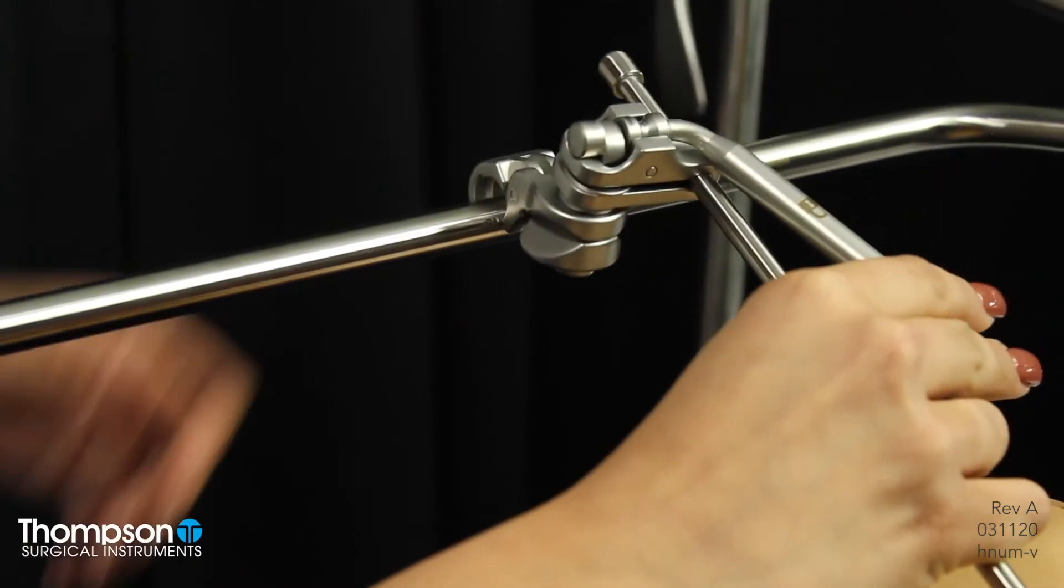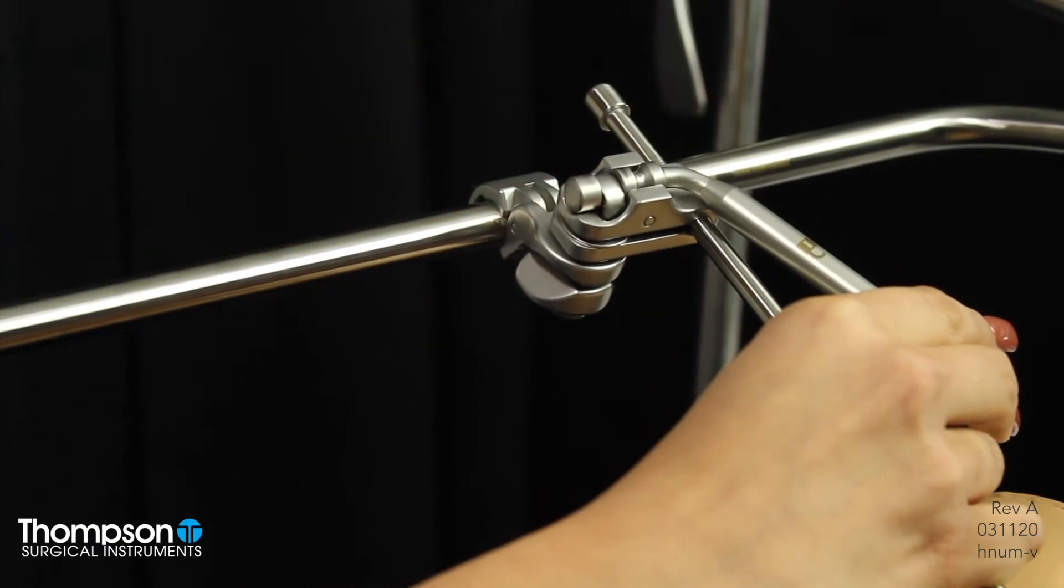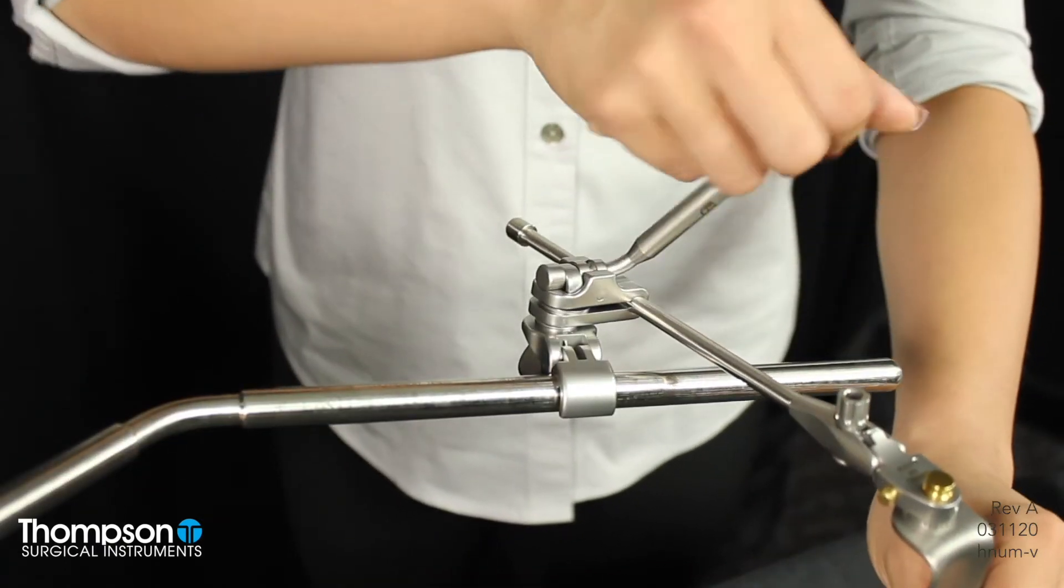With the joint in the unlocked position, clip the handle anywhere along the angled arms or crossbar. Then, flip the latch to lock.